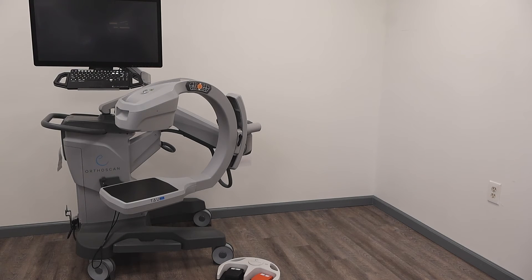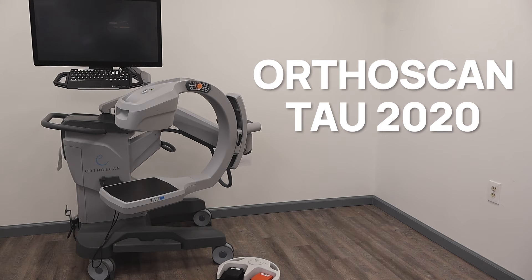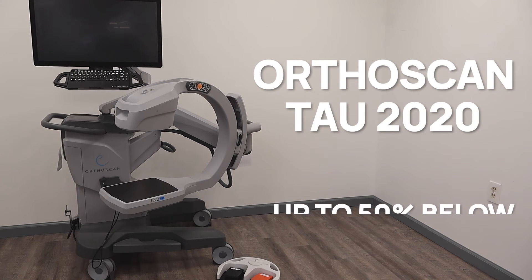Soma Tech International offers the refurbished OrthoScan Tau 2020 Mini C-Arm up to 50% below the cost of new, with the same service and warranty contracts from the manufacturer.